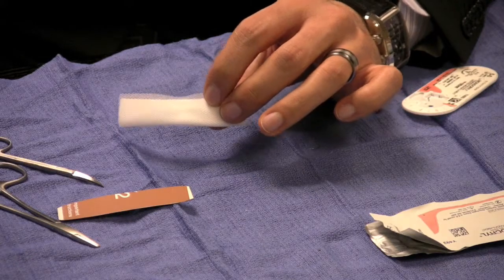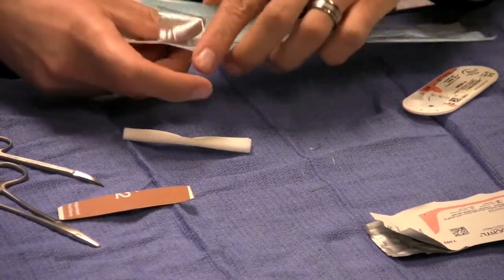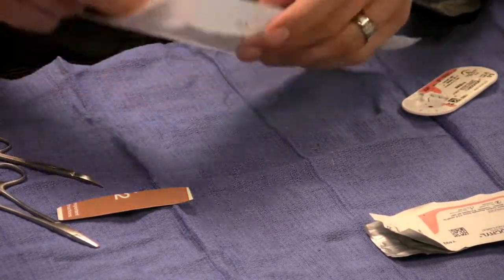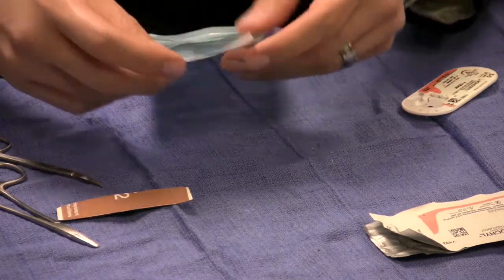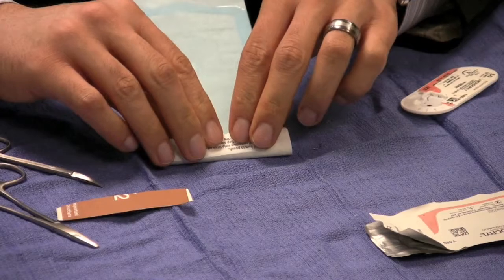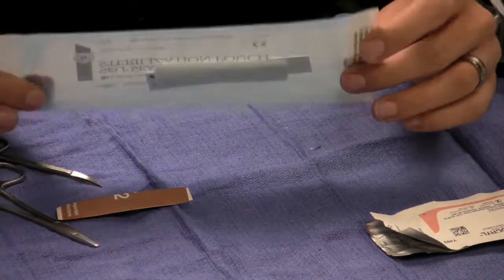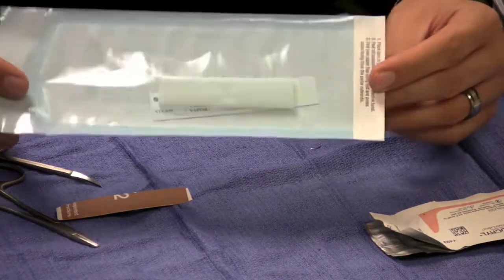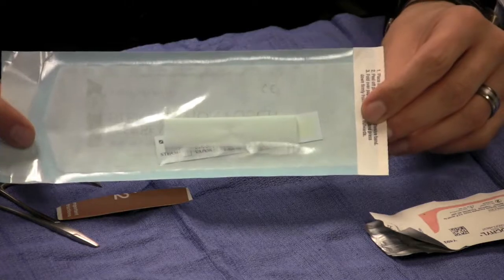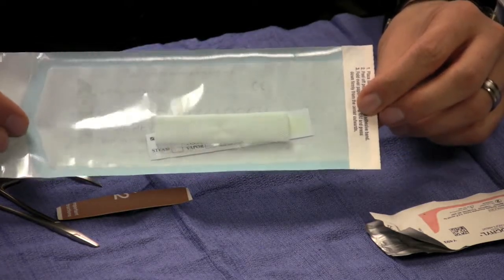So once this is said and done, I take the chin implant, and this is what's called a sterilization pouch. I take this and place it into this pouch, and then we seal the pouch. Once the pouch is sealed, this goes into the autoclave and becomes a sterile chin implant. And during the surgery, once we remove it, it's actually sterile, but I still dip it into a mixture of 2 antibiotics just to make sure we decrease the chances of infection.